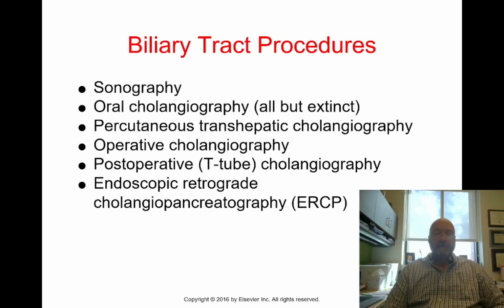So now we're going to talk about the exam types that we'll do for the biliary system. Sonography, being the most common, is out of the scope of this particular program and this recording, so we'll take a look at an image, but we're not going to talk much about sonography. Also, oral cholangiography is not something that's done very often anymore.